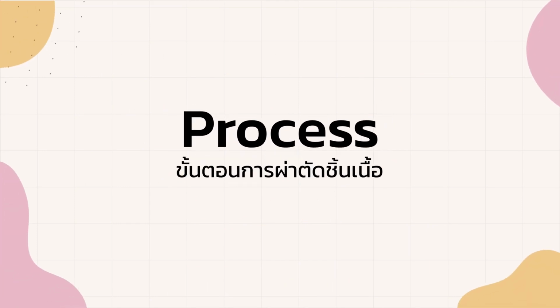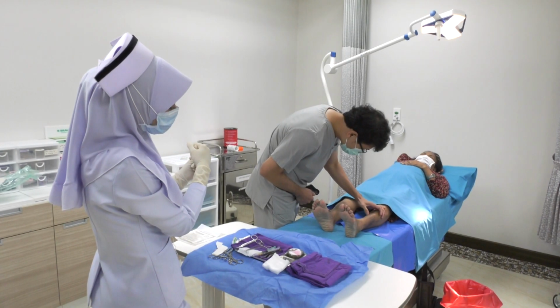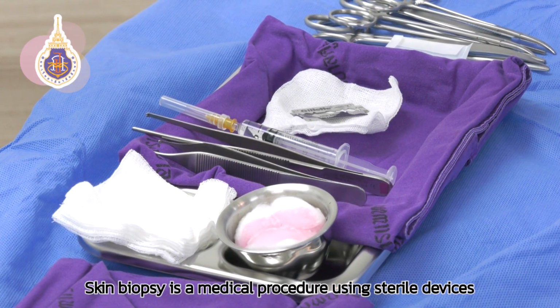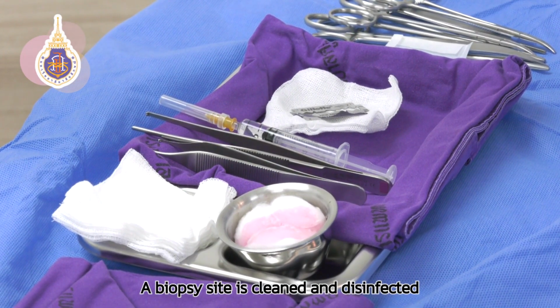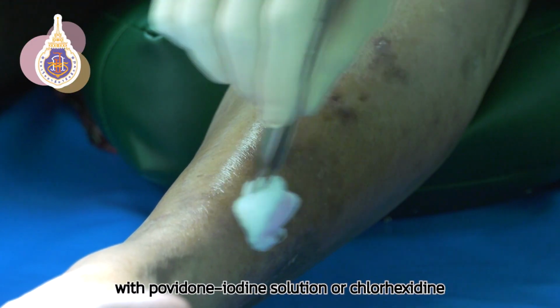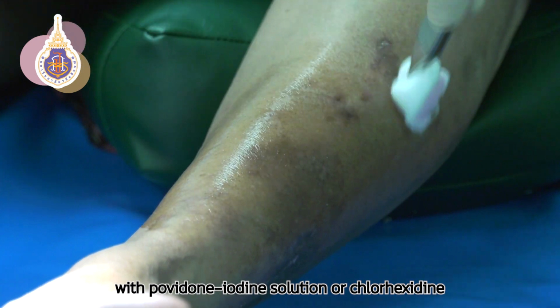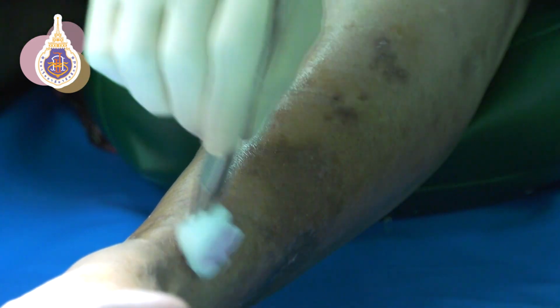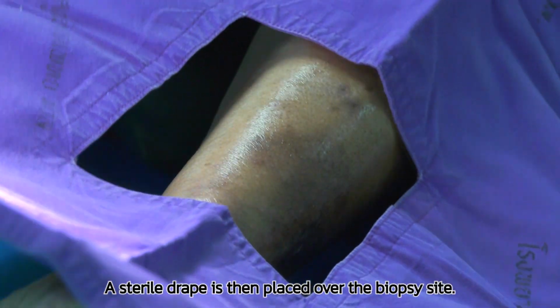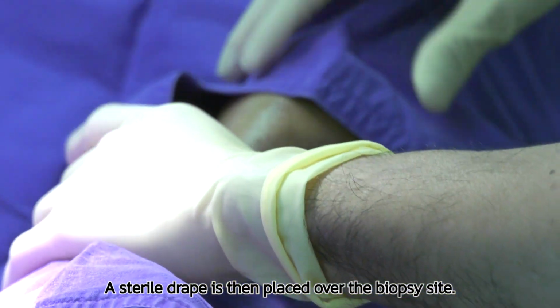Process. Skin biopsy is a medical procedure using sterile devices. A biopsy site is cleaned and disinfected with povidone iodine solution or chlorhexidine. A sterile drape is then placed over the biopsy site.